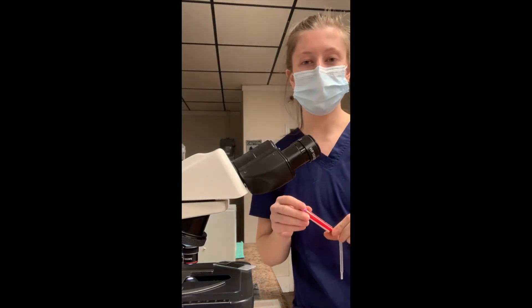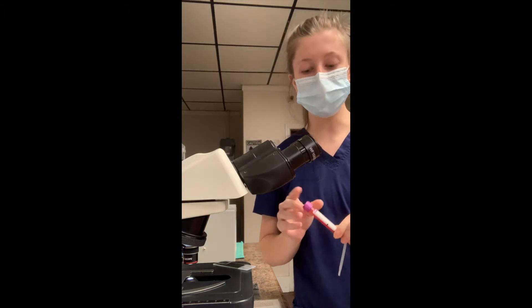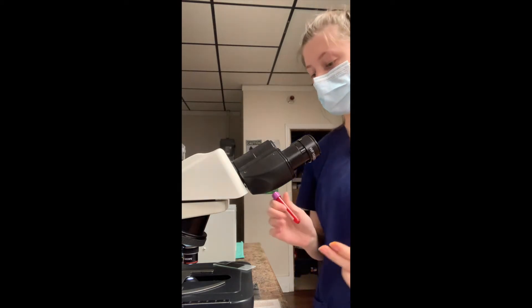Hi, my name is Taylor McGill and today I'm going to be performing the task of checking a direct blood smear for microfilaria. I've got my previously collected sample in an EDTA tube, and I'm just going to go ahead and invert it a couple times.